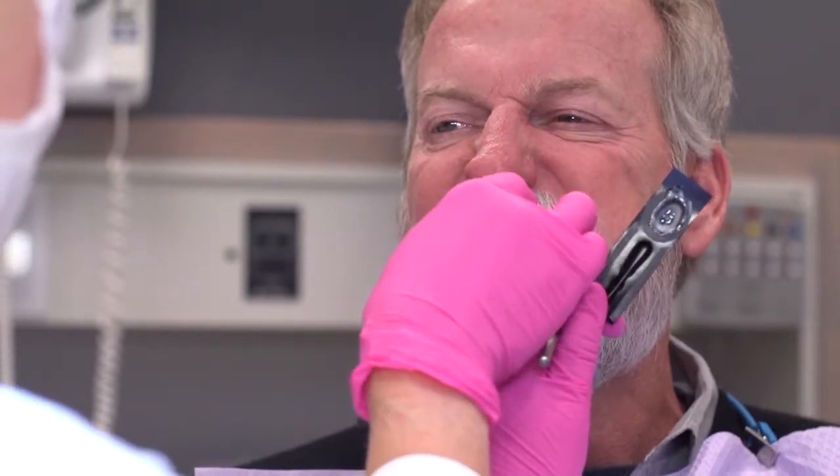Then retract the right cheek, reload your brush, and give it a nice swipe across the maxillary arch. Reload, then swipe across the mandibular arch.